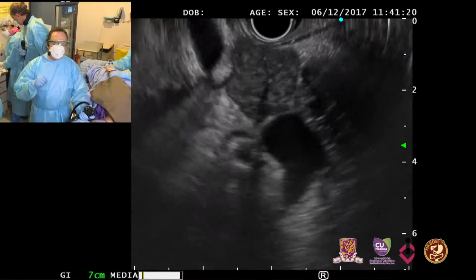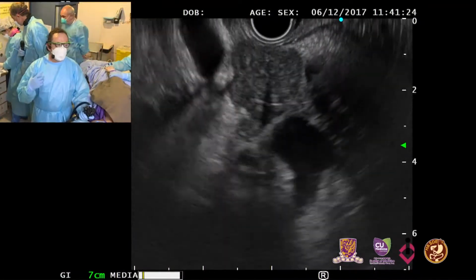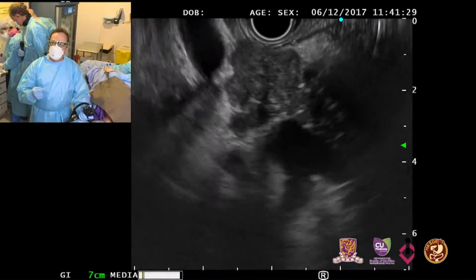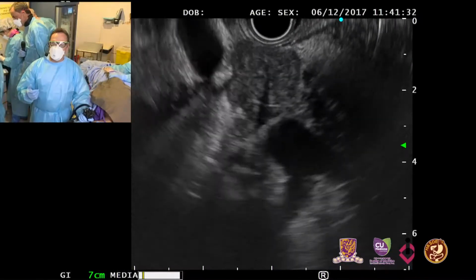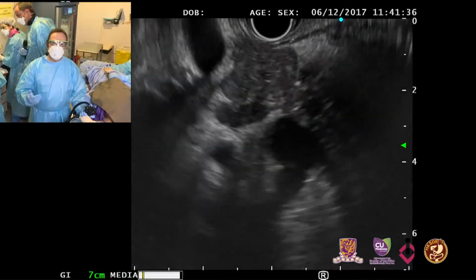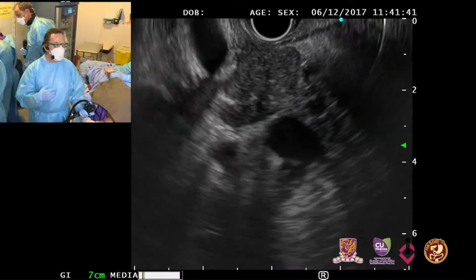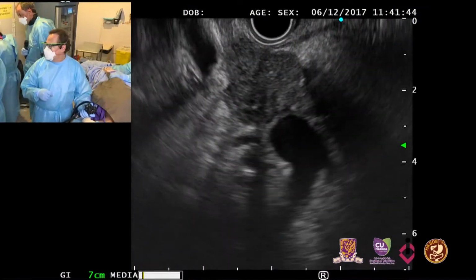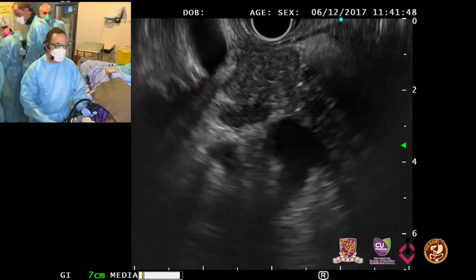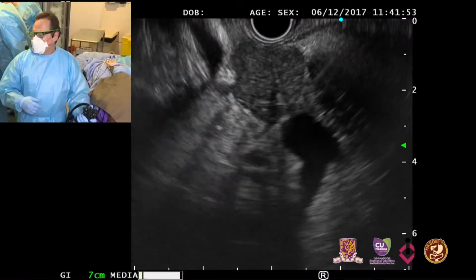So now we're going to flush the needle, put back the stylet first, and then flush it with air into this formalin container so that it can be evaluated. That is the standard technique for FNA, and that is the technique we use for FNB at University of Chicago. And the second pass, what I'm going to demonstrate is what we call a negative suction FNB.